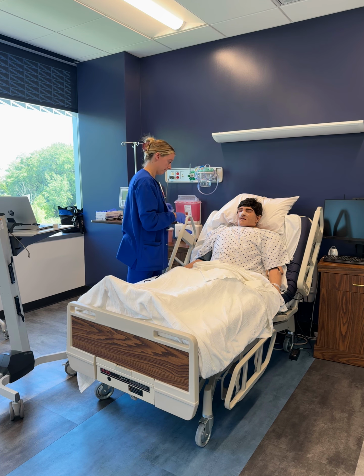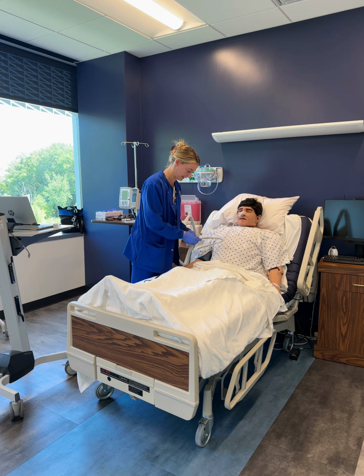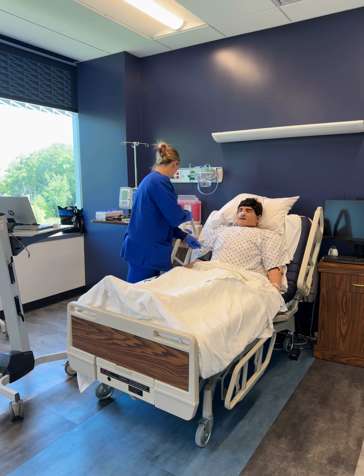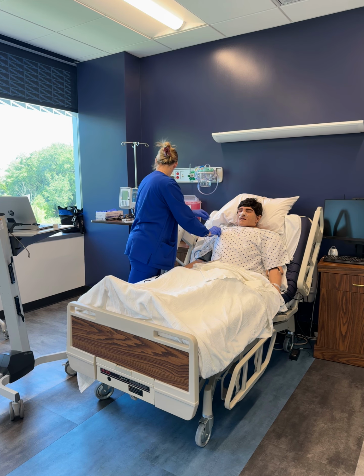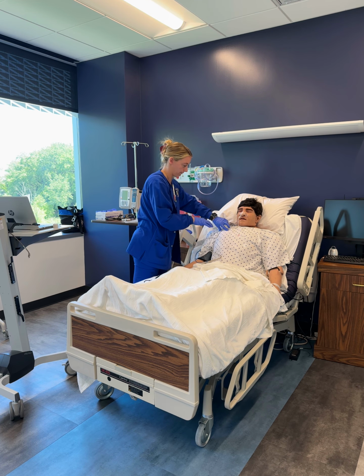I'm going to use a syringe to pull back gastric content. I'm going to test pH, and then I'm going to replace the gastric content into the patient. I'm then going to tape the tubing to the patient's gown to prevent them from pulling.